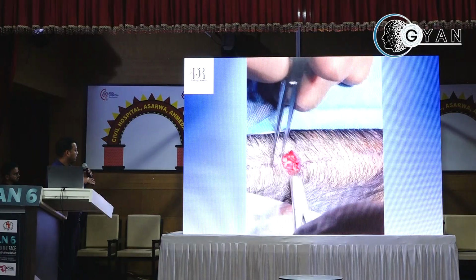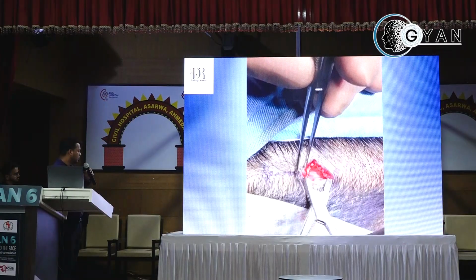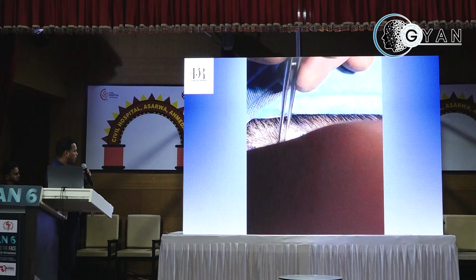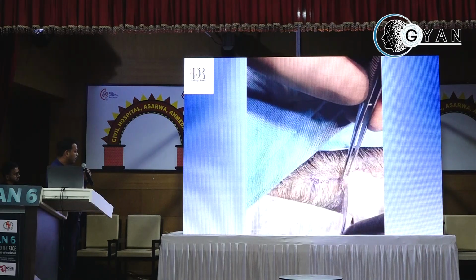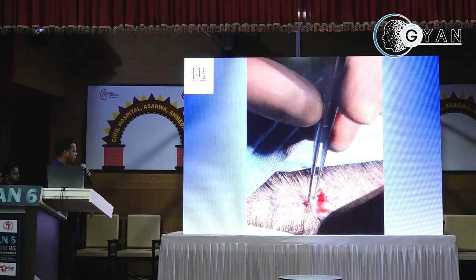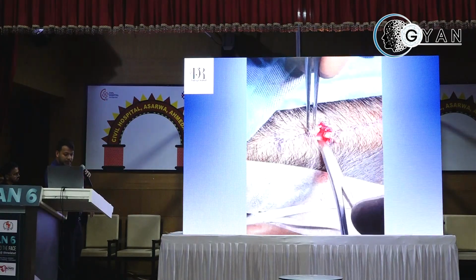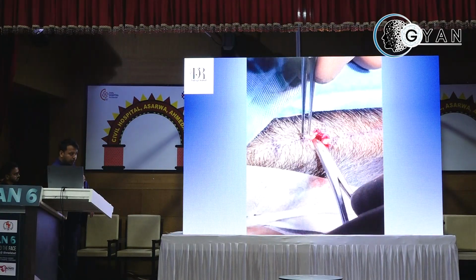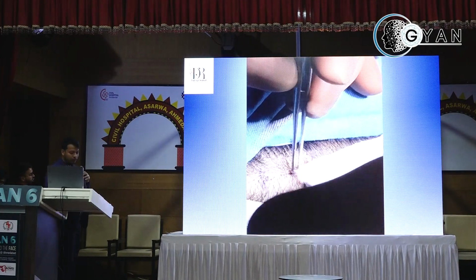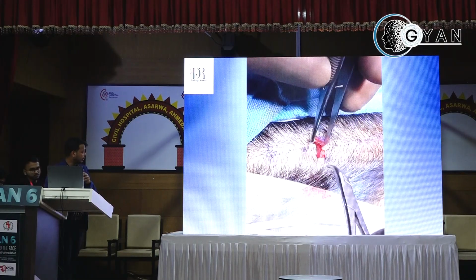Again we retract and go deep. This is all blunt dissection, so that we will not injure any important structures. Once we get the layer, we are in a safe zone. Now here is the deep fascia. Once you get it, the same, and the next incision will be given.